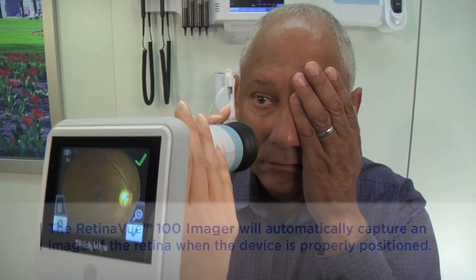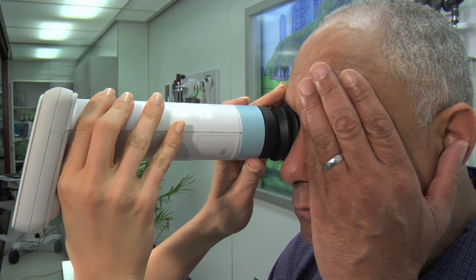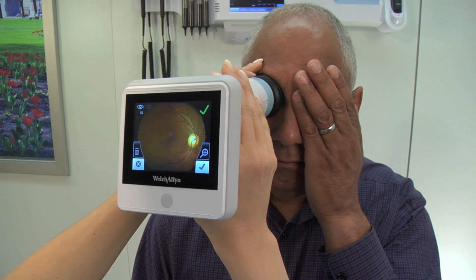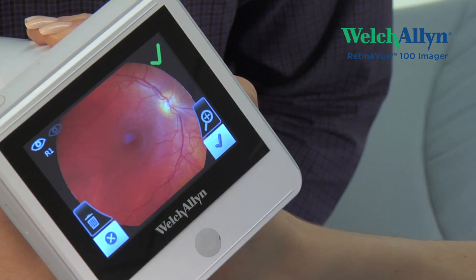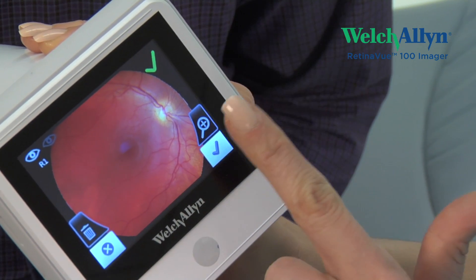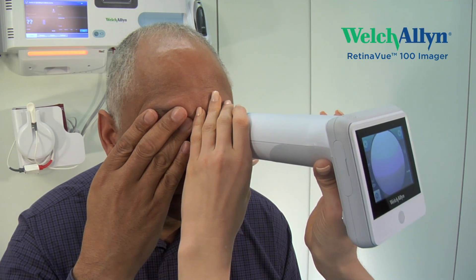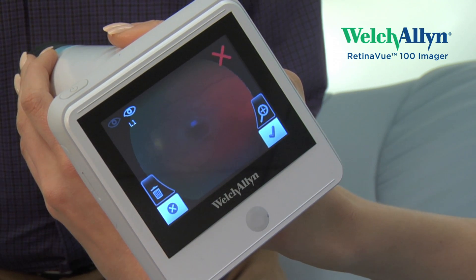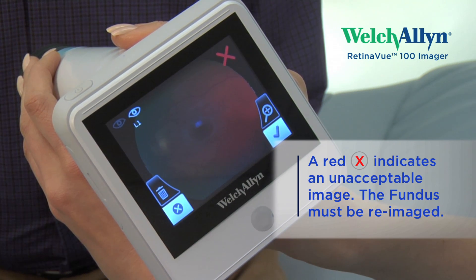The patient will experience a brief flash of light. Note: if the bubble is very large, it indicates that the RV100 is too close. To correct this, back the RV100 away from the patient slightly. An audible tone will alert you that the image has been captured and the acquired image will be displayed. A green checkmark signals the image is of sufficient quality for clinical review. A red X indicates that the captured image was not acceptable for clinical review and that the fundus must be re-imaged.